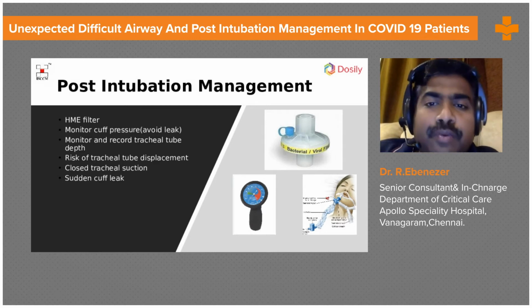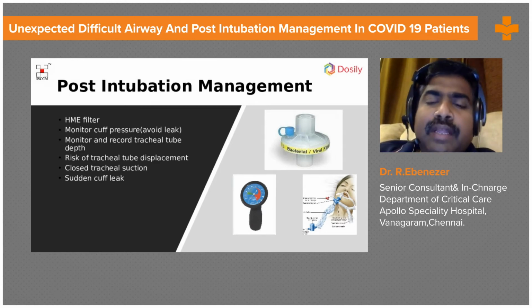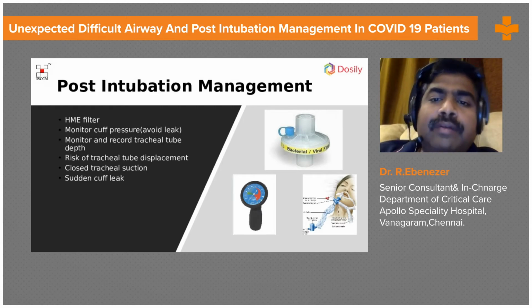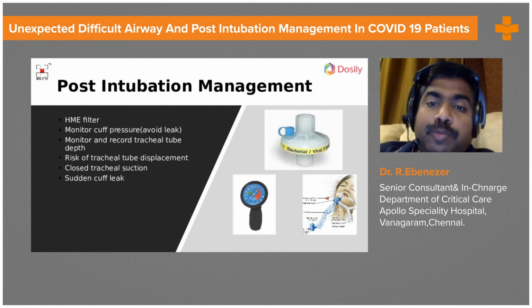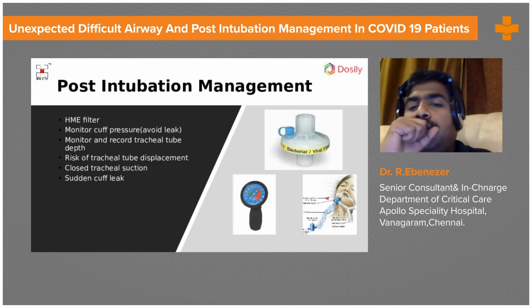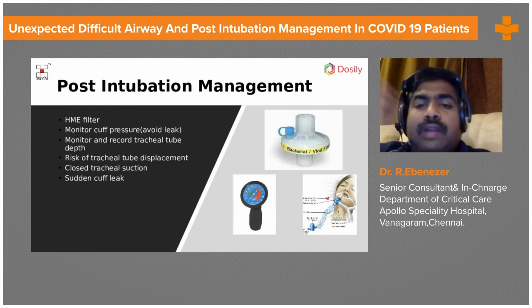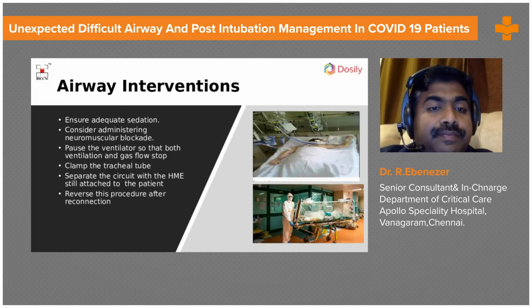But suppose a doctor is there who is not so well versed in intubation, and you need some help from an anesthetist to come in wearing a PPE. You need some time, so during that time there could be a lot of aerosol generation within the room. To prevent that, pack the oropharynx with an ENT pack. You can use that to pack the oropharynx till the anesthetist comes to the place.